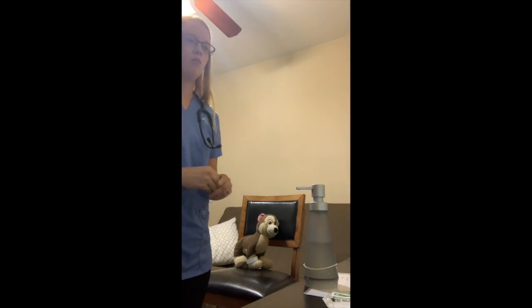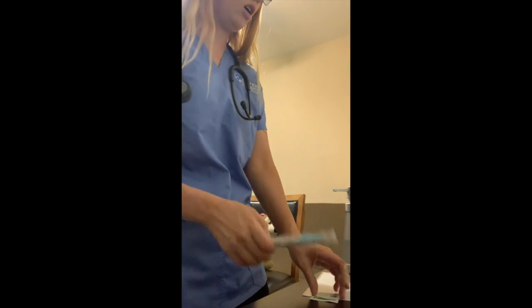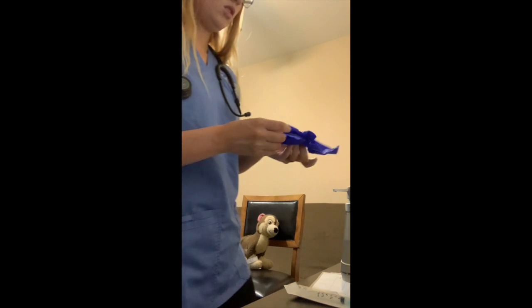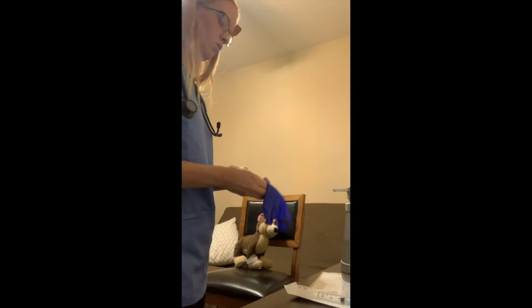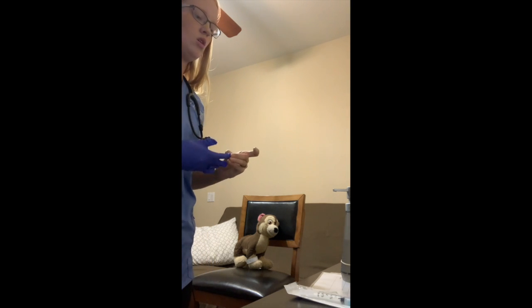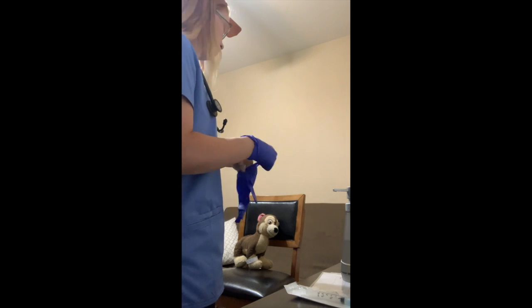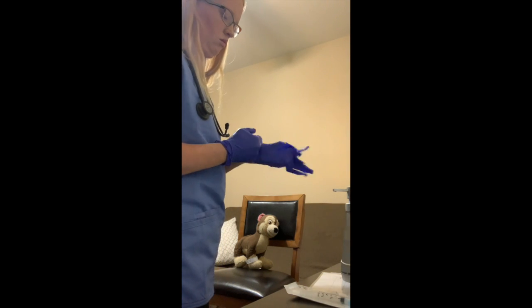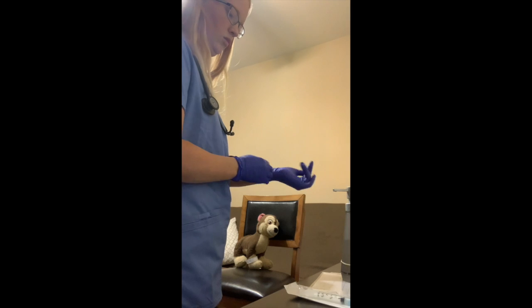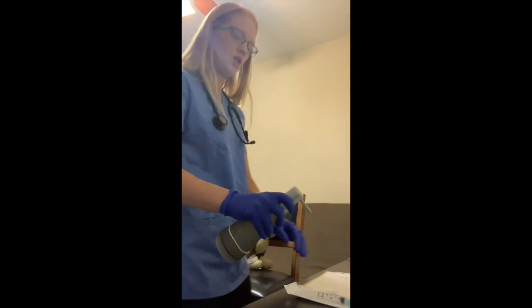Okay, so I already drew up the medication, so that's what I'm going to be giving her. Let me put on some gloves, and then I'll come back and check on her in a few. All right, so we're just going to scan the area, beep, scan the medication.